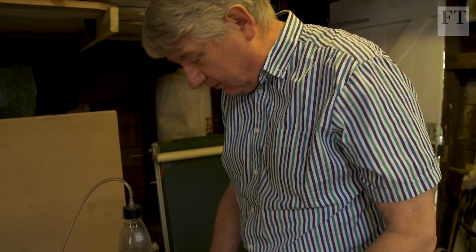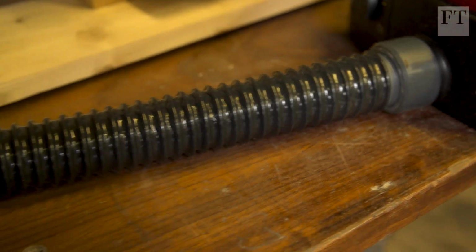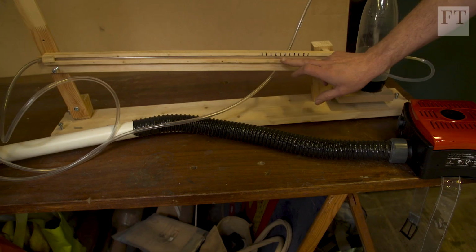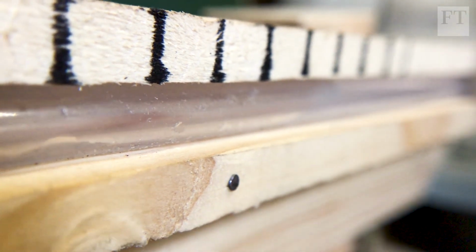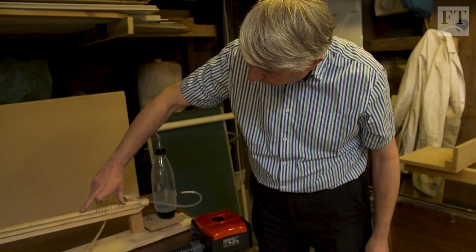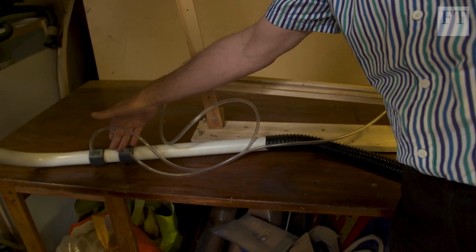What I'll do, I'll start the air pump. So we press it there, the fan starts to run, and that is pumping air now through the tube, and you can see here this is what we call an inclined manometer, and this gives us a measurement of the airflow rate. So where the water moves up the sloped pipe, the relative movement of the water is a measurement of the airflow as indicated through the Venturi meter here.